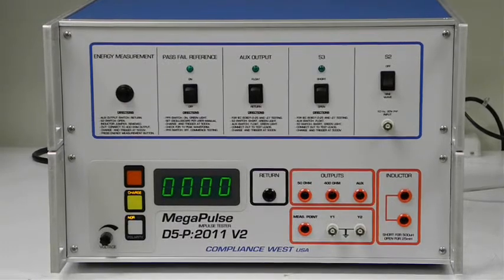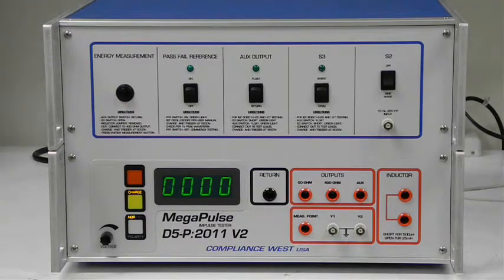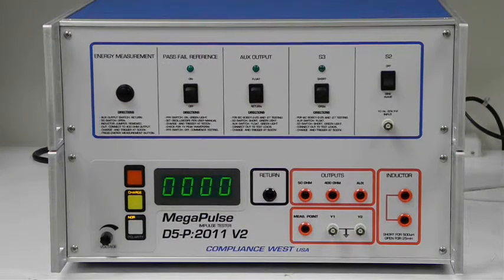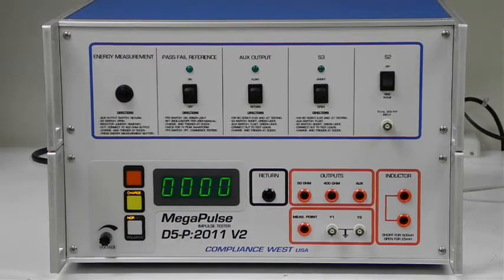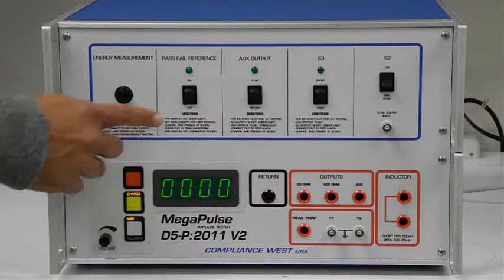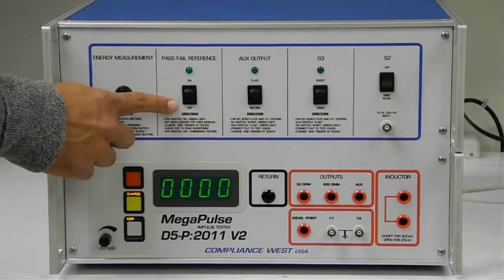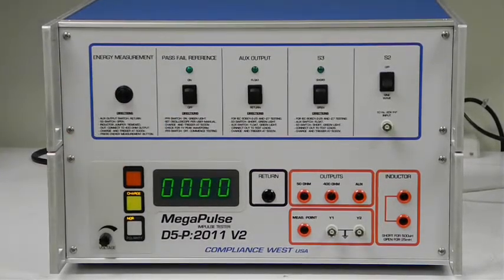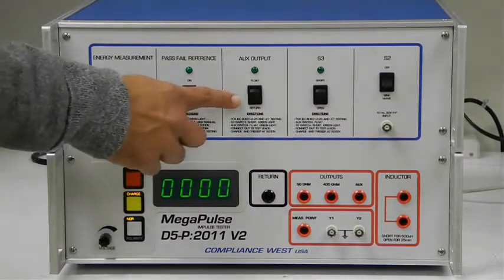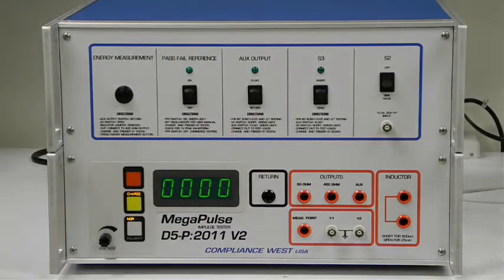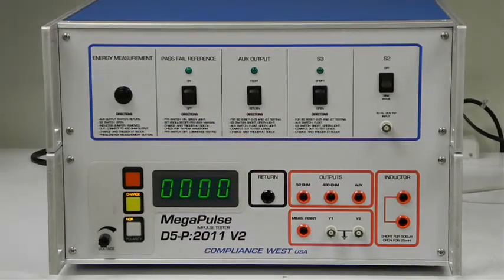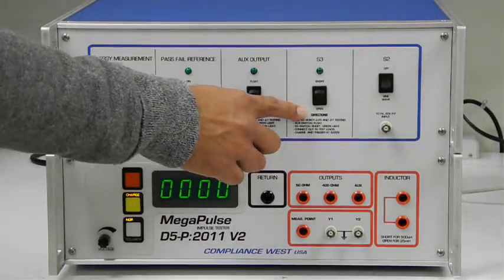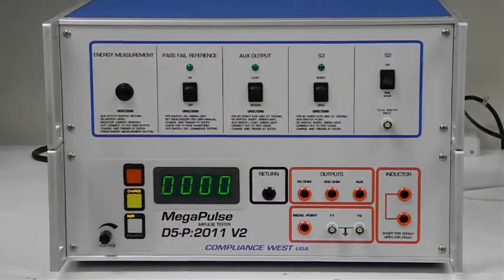Set the other front panel switches as follows: Pass-fail reference off, Aux output return, S3 open, S2 off.